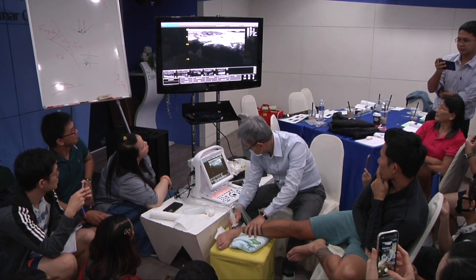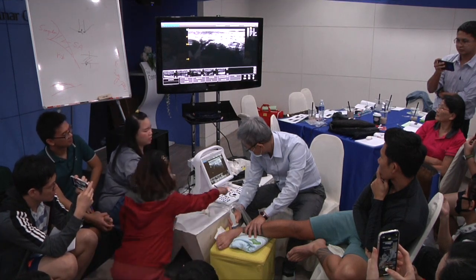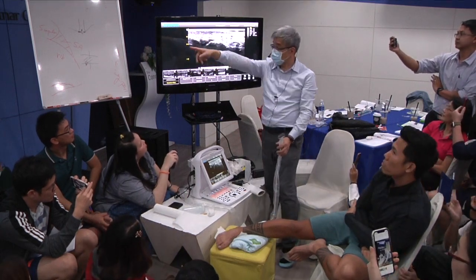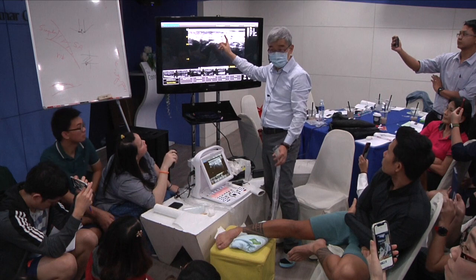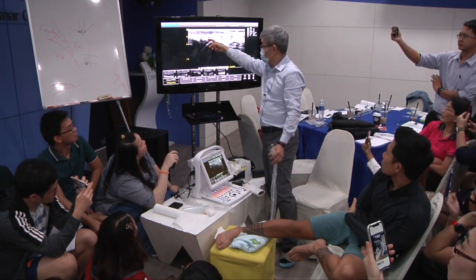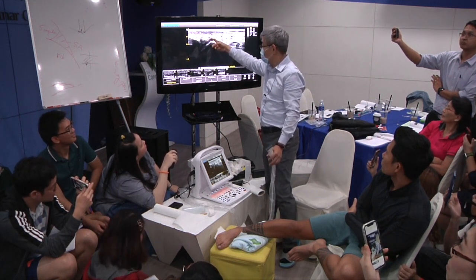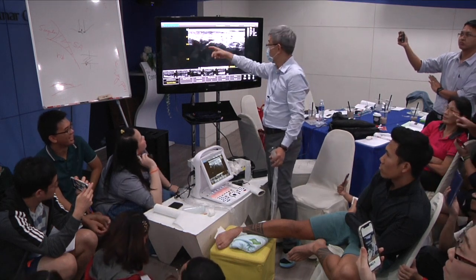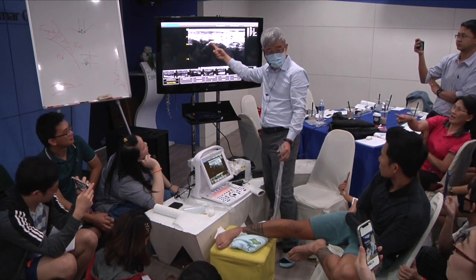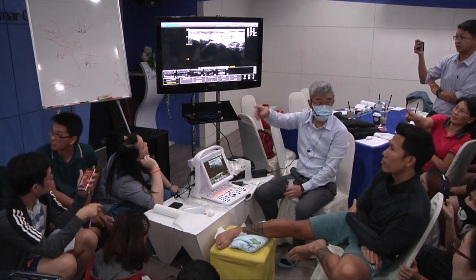Oh. Okay, freeze. Good. Fiber, 3 million baht, 30,000 baht. Good. One line costs you 50,000 baht. If you want more lines, buy that one. If you want to practice, this is okay, I think. You're right? ATFL fiber. Can you see that? Right? Okay.